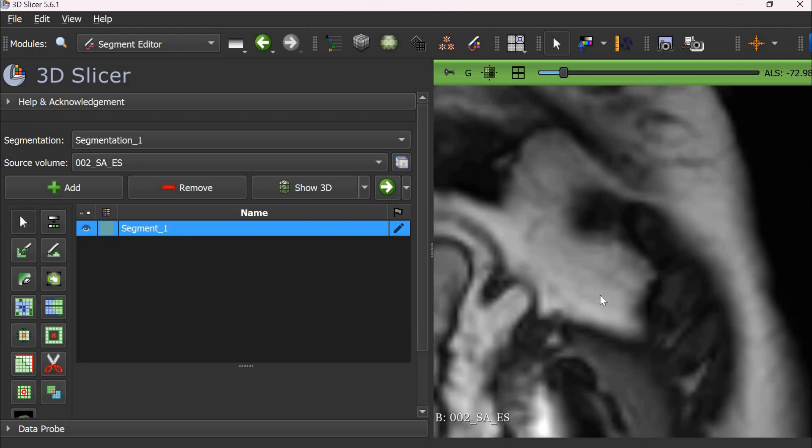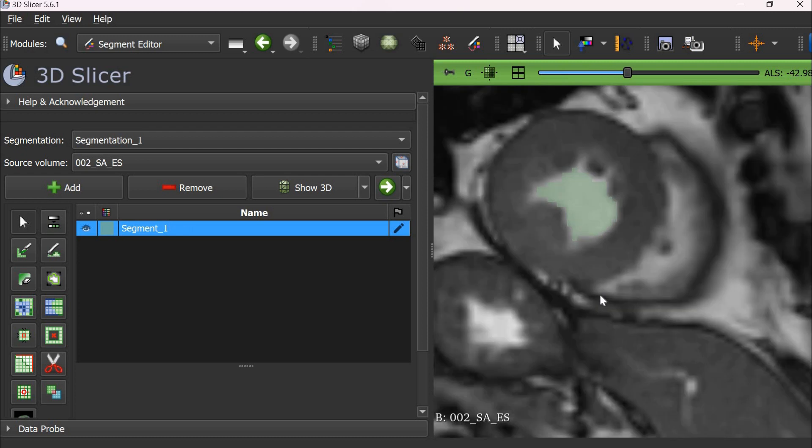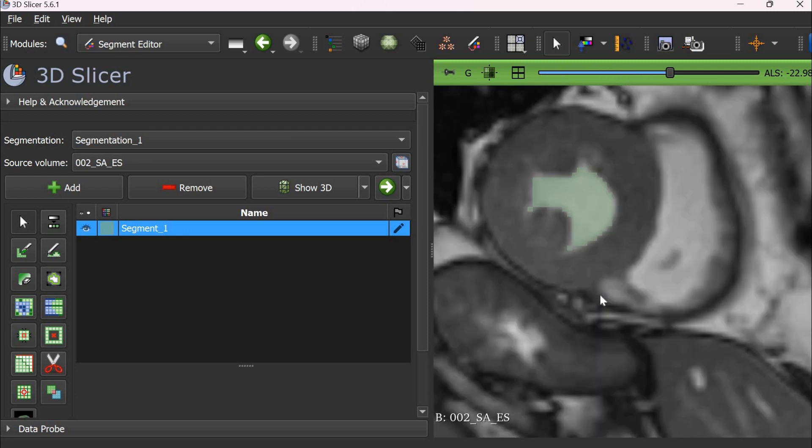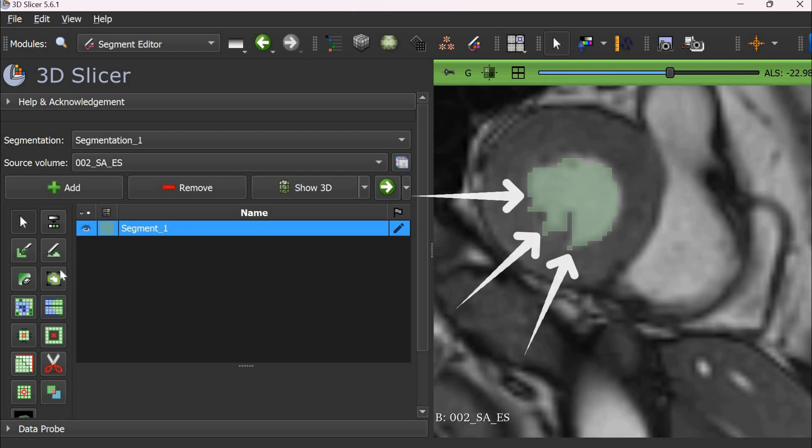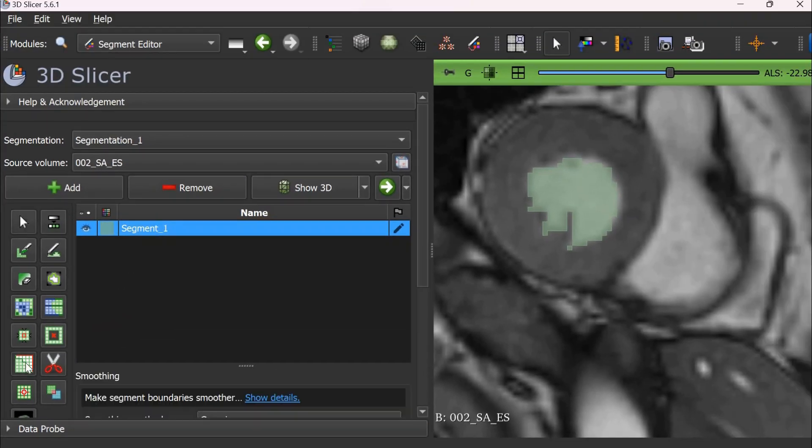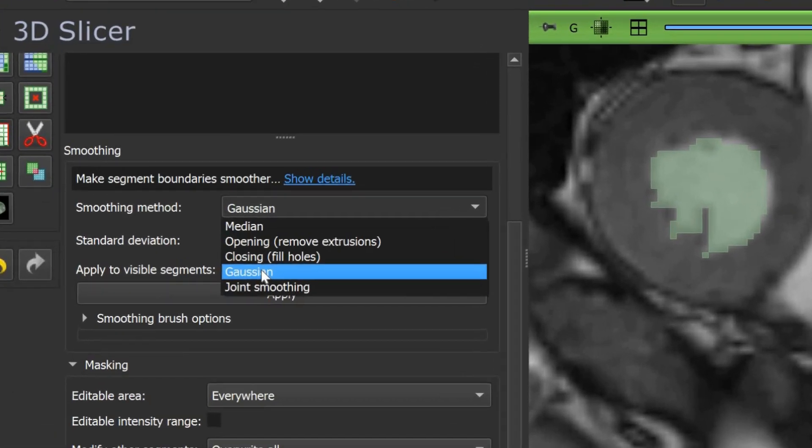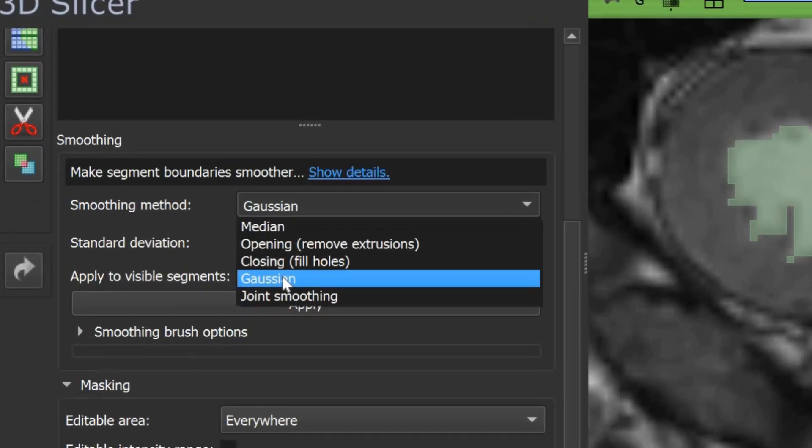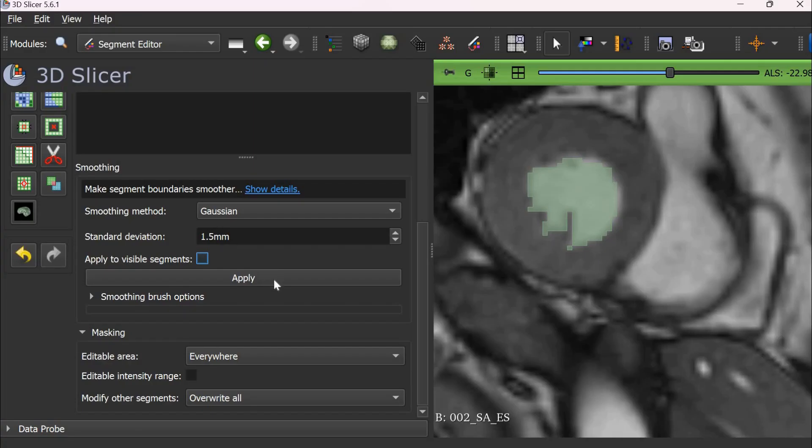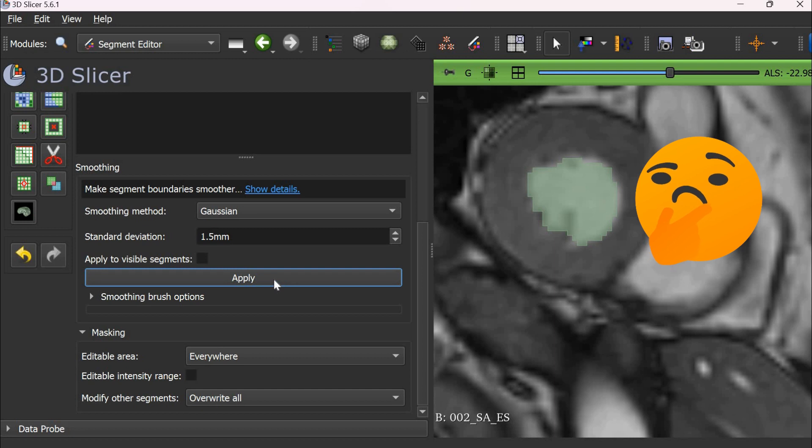Now you notice that the masks are not very smooth and they have jagged edges. For this, you can choose smoothing function. Gaussian smoothing works well for me. Otherwise, you can choose any other type of smoothing. Use 1.5 mm and then click apply. If it doesn't look good in the first application, you can apply it once more.